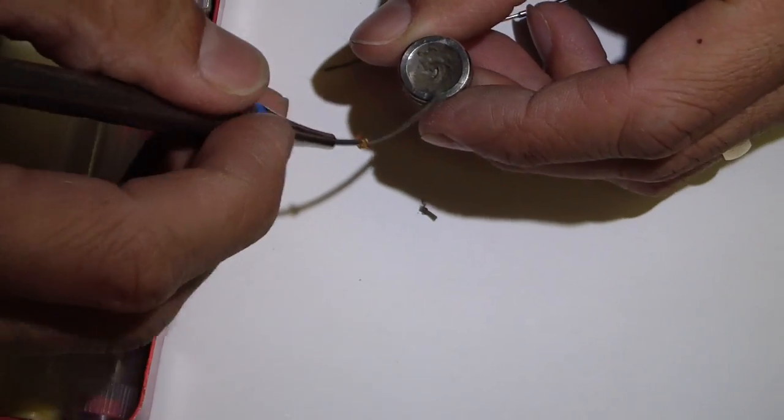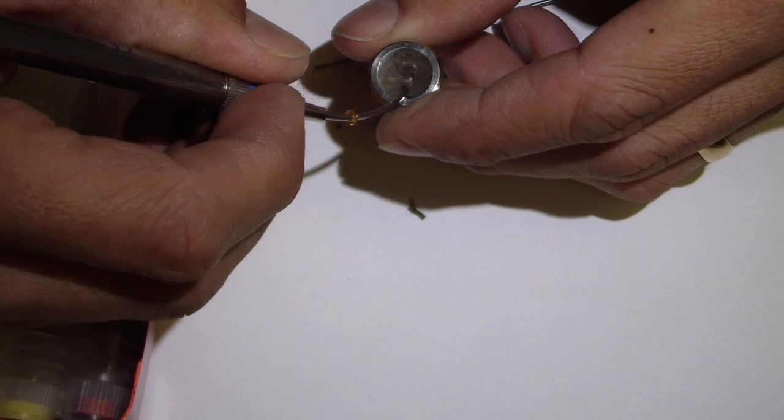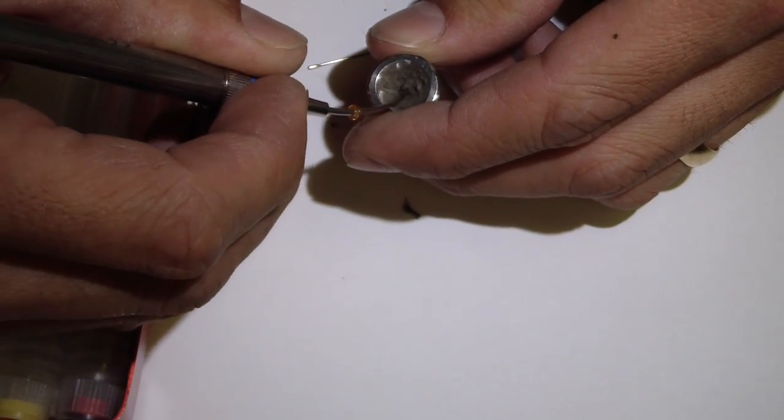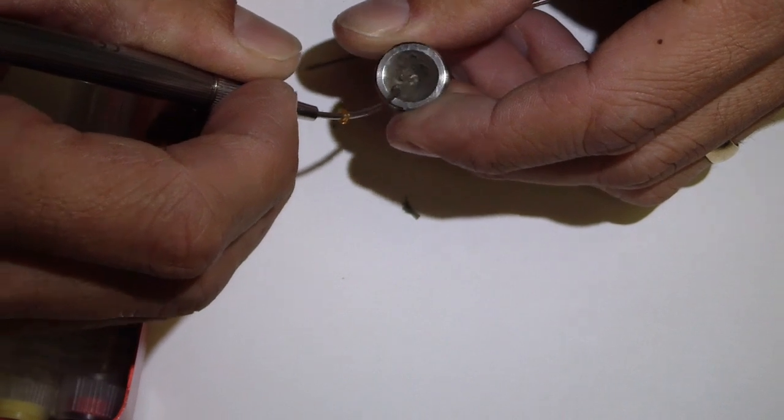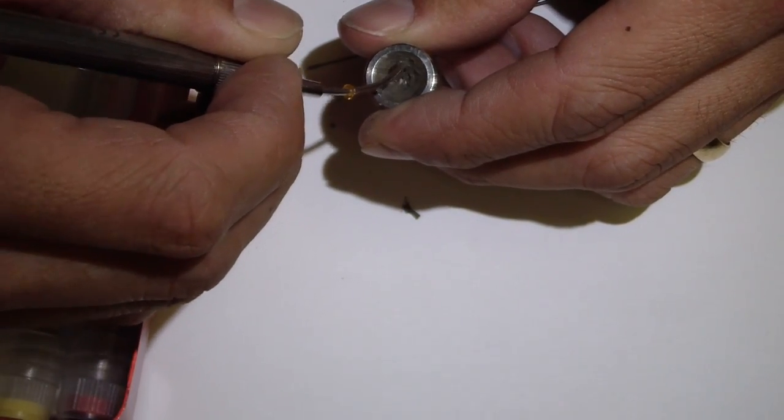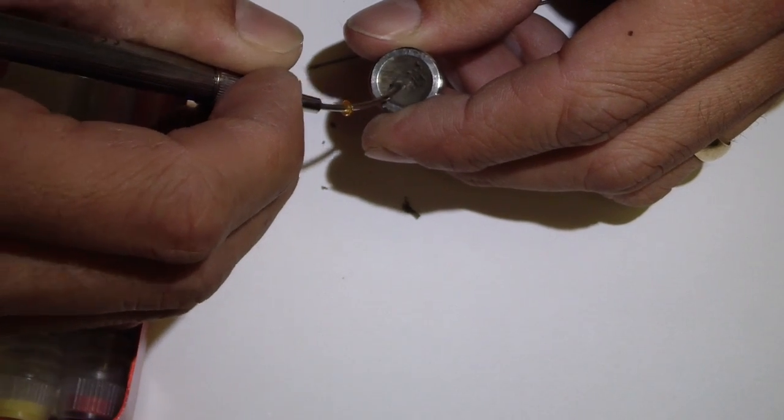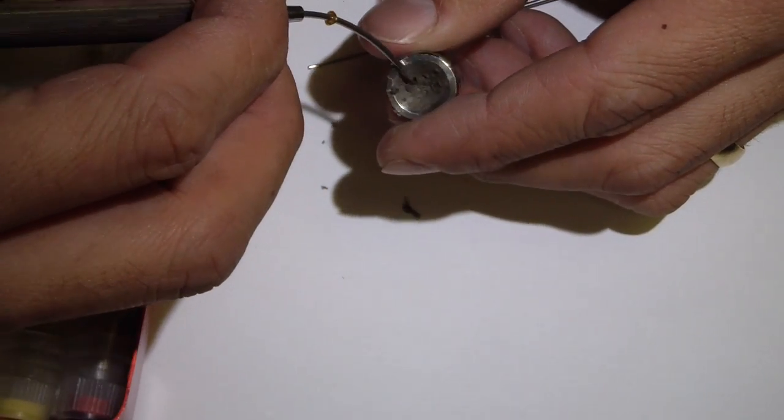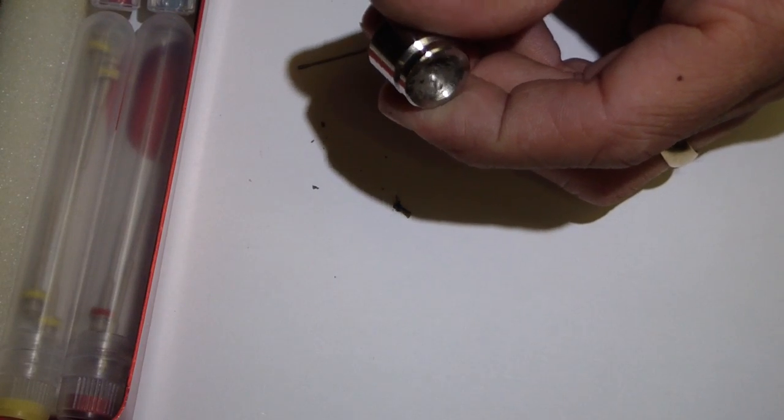Let's try this one more time. We're going to place it into my furcation perforation that I made. So again, I'm just packing it in, condensing it into the carrier. You can do this any way you want. Secure your little dappin dish.